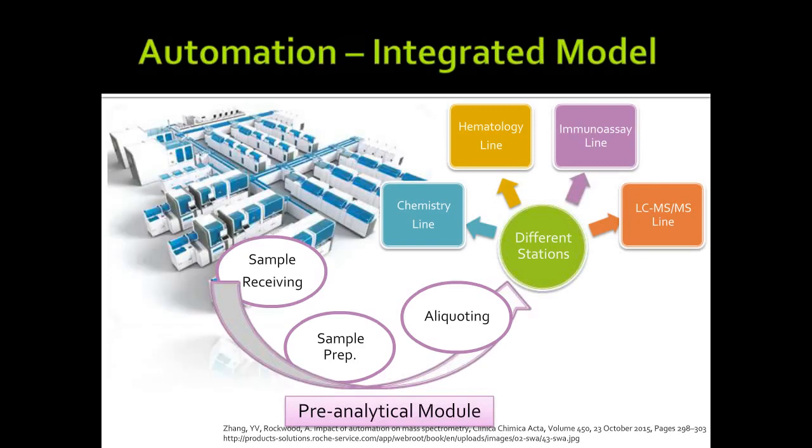This is also a massive and very impressive pipeline that we can find online. So this is basically the line here. We go to different stations, or we can use the line this way, and one of them is mass spec. Those are all interesting ideas to think about. They're certainly going to solve some of the challenges that we have with automation. I know we have some automated, or more standalone, systems on the market now. I'm not going to go into a deep conversation on that, but I think we're making very big strides in this area.